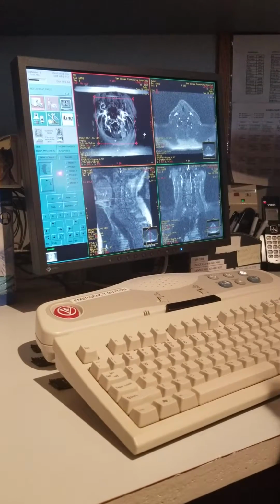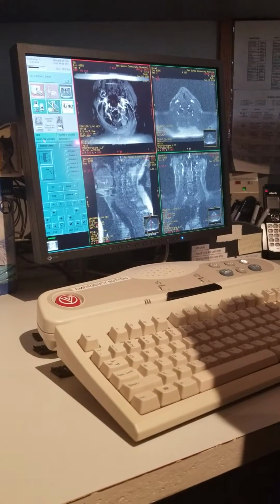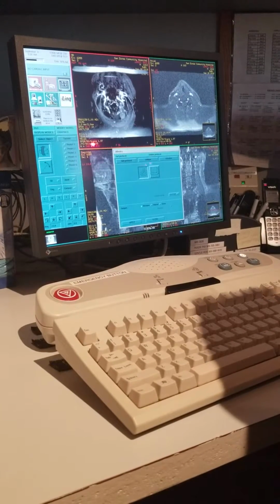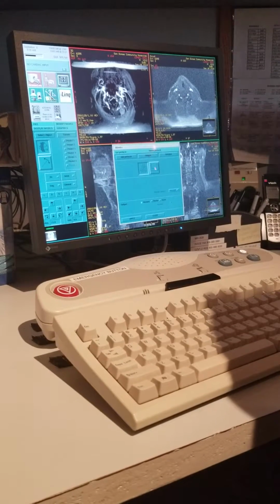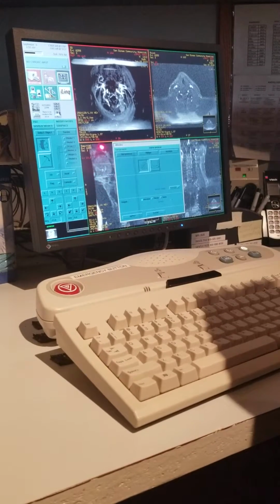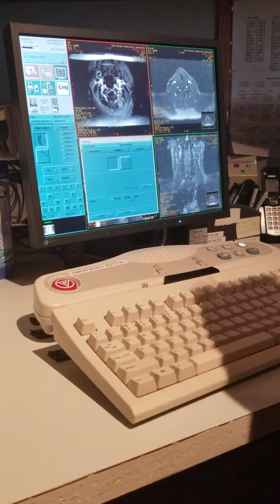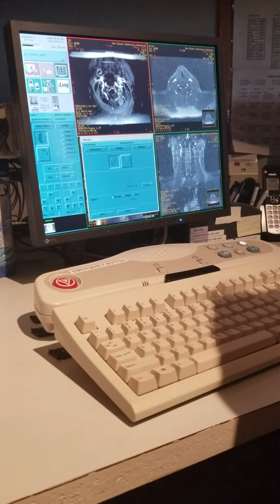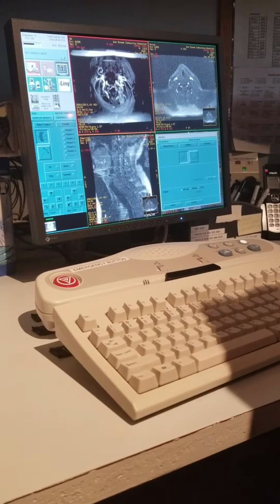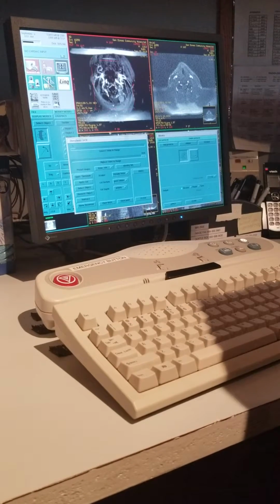That's fine. So we're going to display modes. Display modes, set batch movie loop. We're going to move that box into this box here. Grab the edge and drag it over here into this box. Now we're going to go modify model. Actually, move that over here, and then go modify model, threshold VOI. And then move that one into this box.